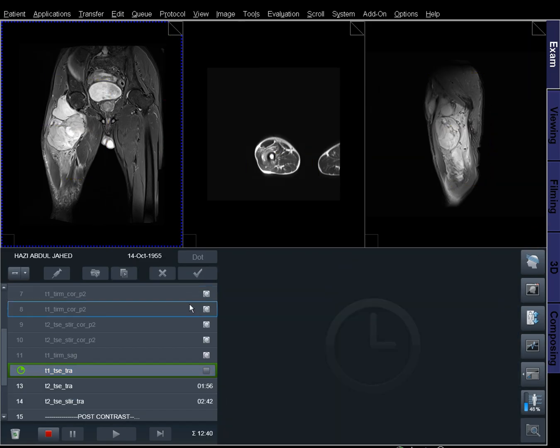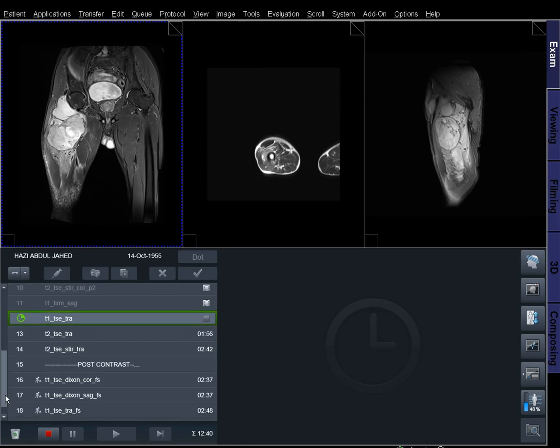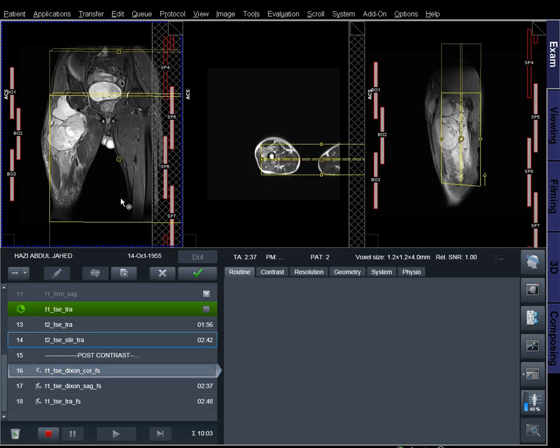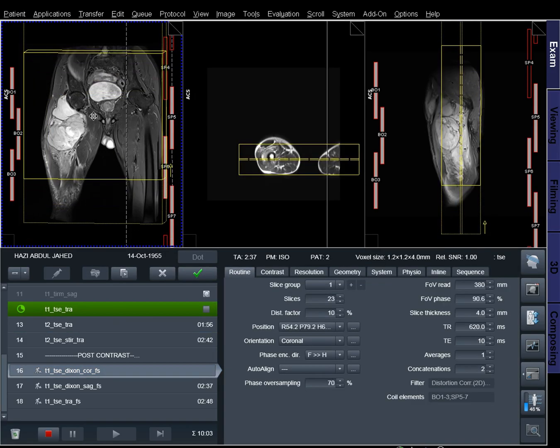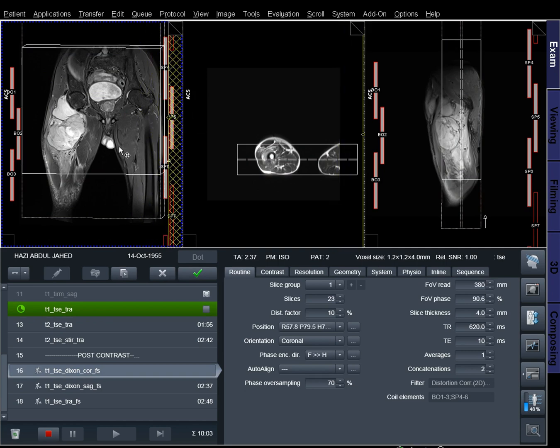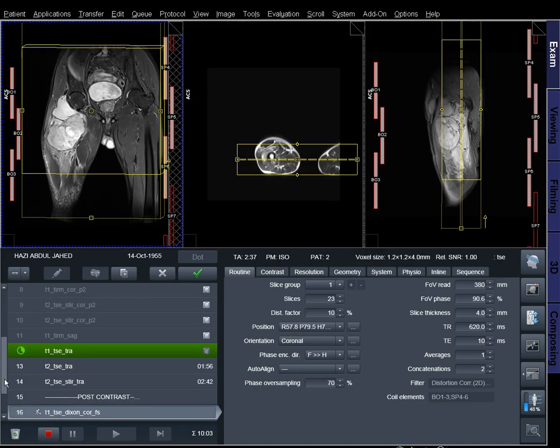Contraindications. Any electrically, magnetically, or mechanically activated implant, for example, cardiac pacemaker, insulin pump, biostimulator, neurostimulator, cochlear implant, and hearing aids. Intracranial aneurysm clips, unless made of titanium. Pregnancy. Risk versus benefit ratio to be assessed.